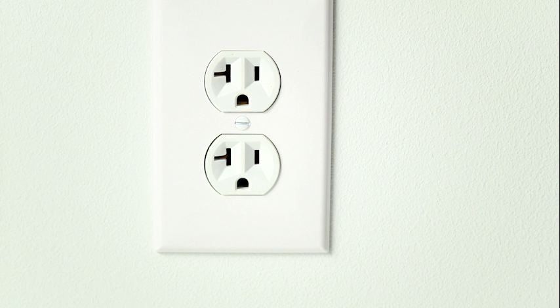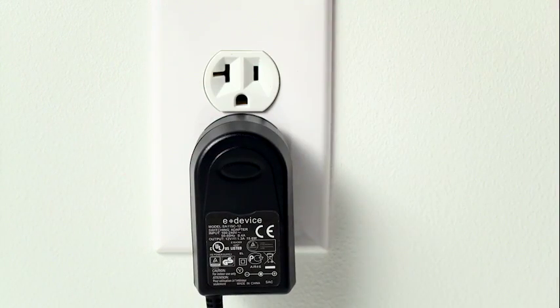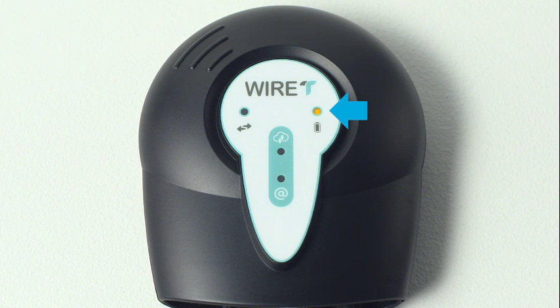The last step in setting up your internet accessory is connecting it to power. Plug the power supply into an available electrical outlet. The light above the battery icon indicates the accessory is receiving power. If you do not see a light after plugging the unit into the wall, check your connections, making sure the power cord is pushed all the way into the back of the internet accessory.